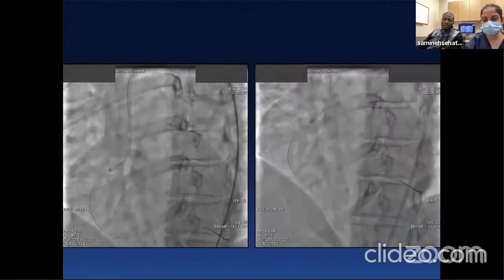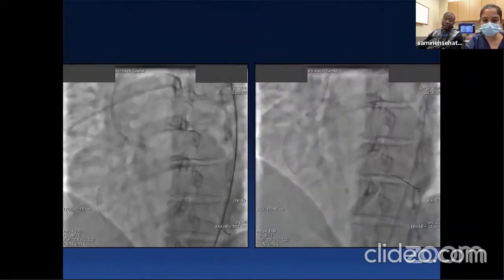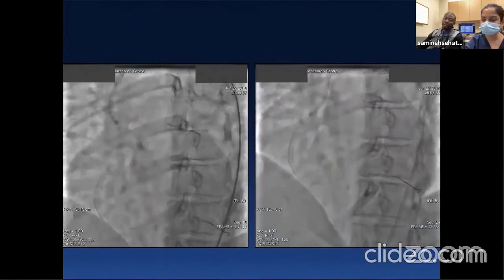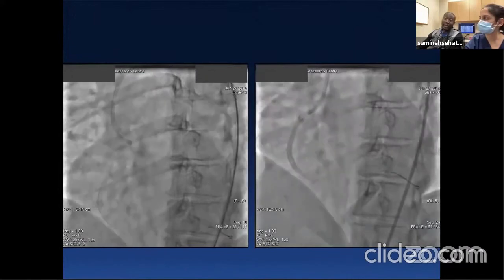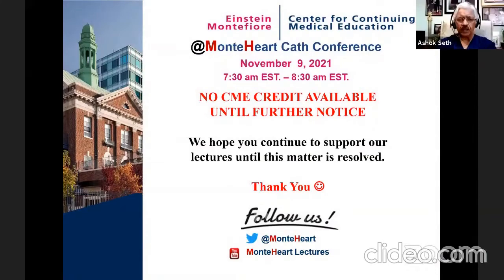Because what sizes do they usually come in? I ask this question because if you're a new attending faced with an acute coronary syndrome in the middle of the night, after finally engaging this coronary, you may now be faced with some sizing issues. Thank you. Yeah, I think once you've intubated them, and if you've really got good intubation, then you can get your imaging catheters down. That's very clear.